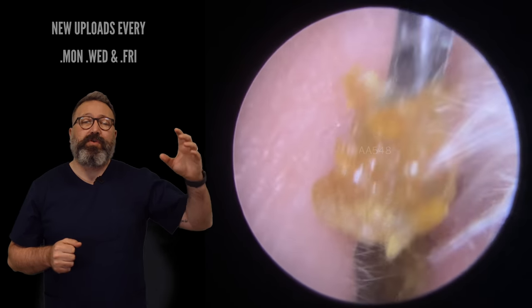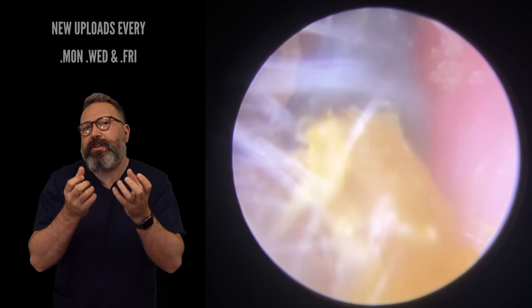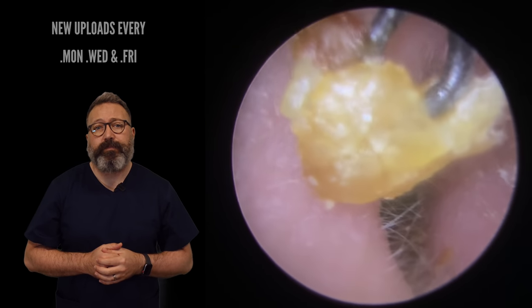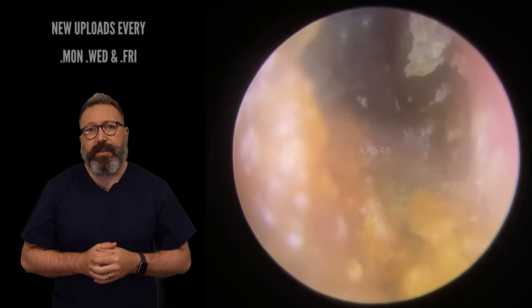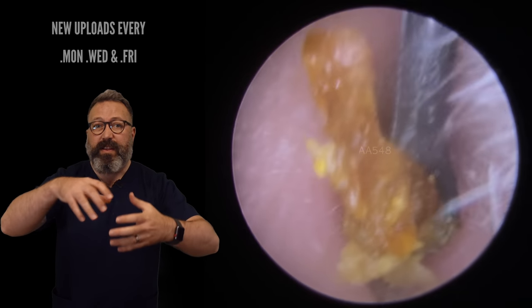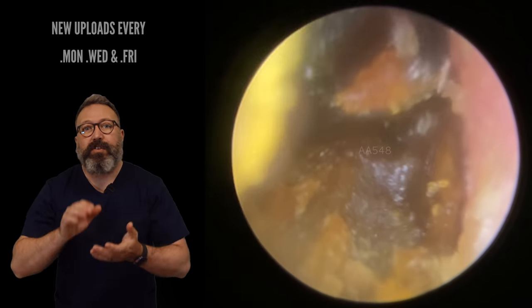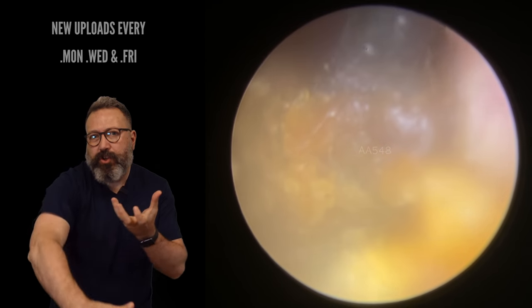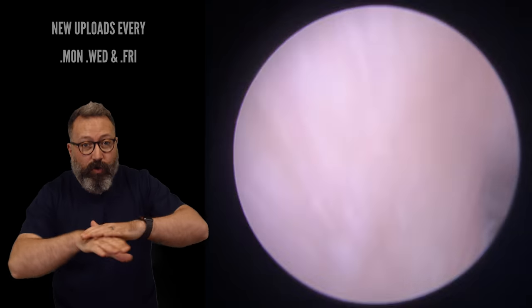It's really coming away. Now, if you saw Wednesday's video, we had that kind of armadillo wax — this isn't quite the same. It's really tough on the outside, but the center isn't quite as soft and squishy as that one. It is a little bit softer than the surface, but coming away really nicely with the Jobson horn. We can just start to see that back section. We'll get rid of the front section first, because ideally I want to roll the back section down. If I do that while there's still stuff at the front, it's going to be like rolling a snowball — you'll end up picking up more and more. So the trick is to go over the top, press down ever so slightly, look for that harder chunk, and then scoop. We just missed it. You're trying to scoop that bottom, harder section forwards, and then the whole thing tends to slide out.